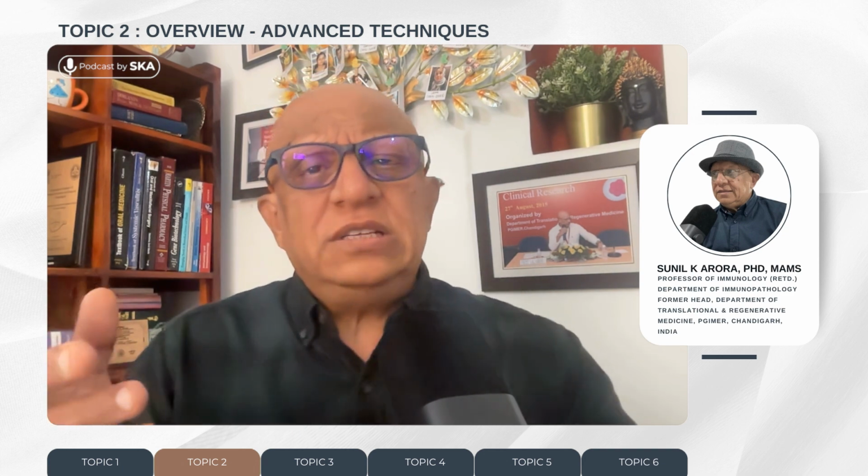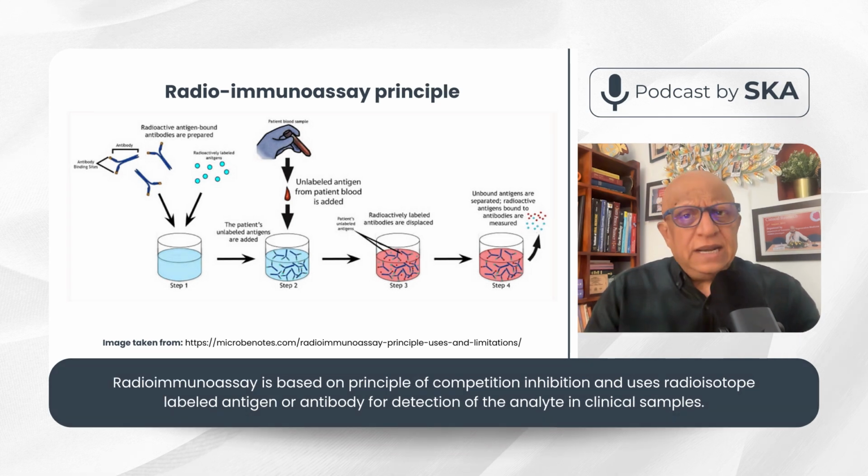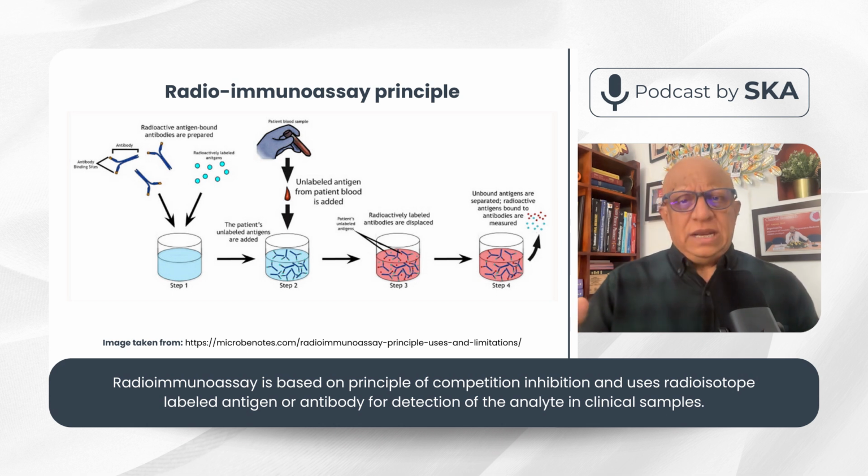The radioimmunoassay is called radioimmunoassay because there is a use of a radioisotope label, which will label either antigen or antibody. The technique is a kind of competitive inhibition assay, and the labeled antigen or antibody will compete with the unlabeled antigen which is present in the clinical sample, and then the difference is measured by whatever remains unused, labeled, which can be done by counting the radioactive component of the reaction.